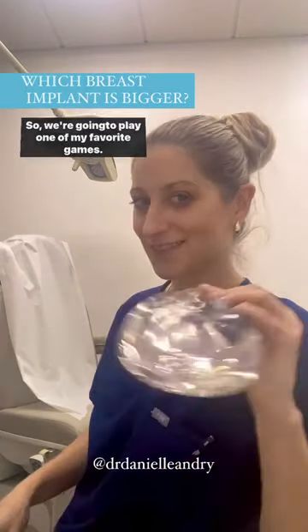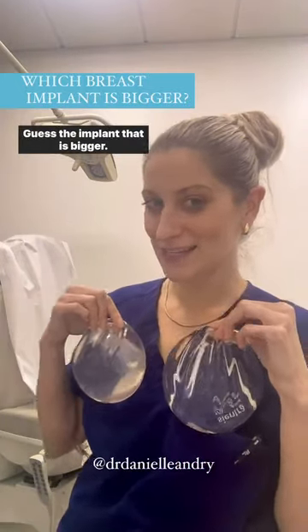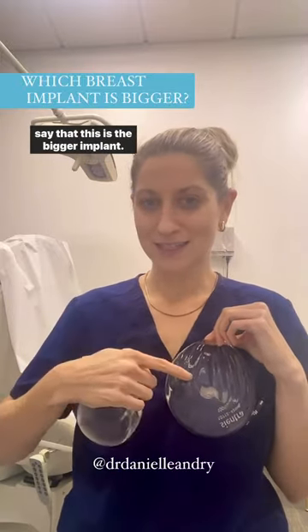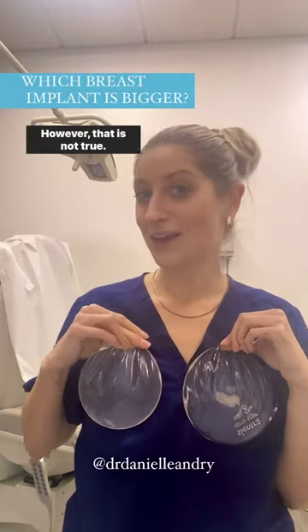We're gonna play one of my favorite games: guess the implant that is bigger. I'm gonna hold them up right here and most people would say that this is the bigger implant. However, that is not true.